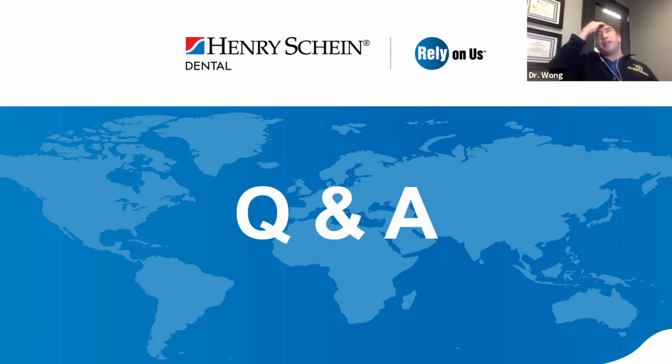And I would say non-engaging is always nice, especially if the implants are kind of offset, because you don't have to worry about the orientation of everything, right? It's just non-engaging. So what that means is that your abutments fit over the whole hex or whatever the attachment is.